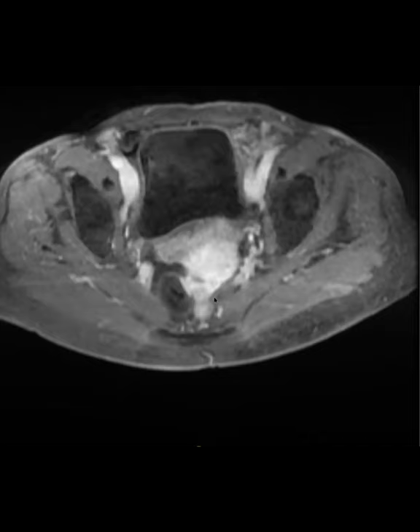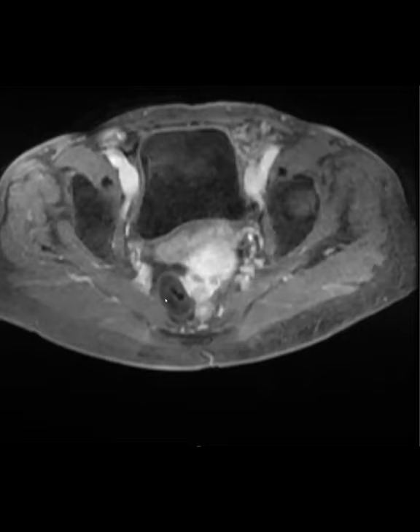Yeah, I really wanted this case to be a teratoma case because that would go really well with paraneoplastic syndrome. But I think this is not a tooth and there's no fat, I guess. I Googled and it says mature cystic ovarian teratoma without intracystic fat. It doesn't exclude. When I first saw it, I totally agreed with you. I thought that looked like a tooth, something you would see in a dermoid. And I don't think lack of fat excludes a dermoid.